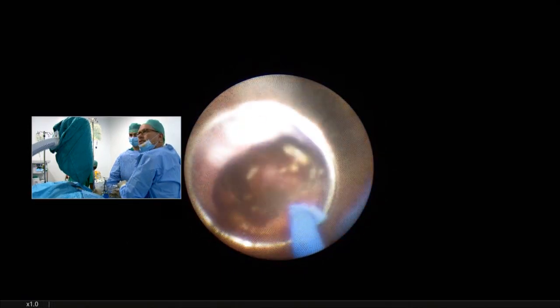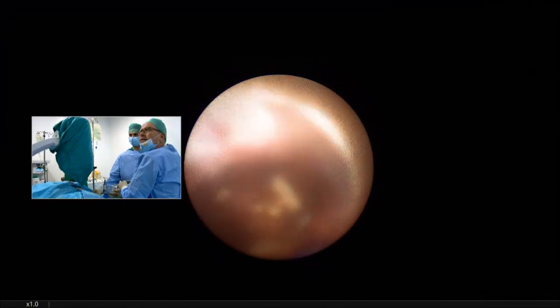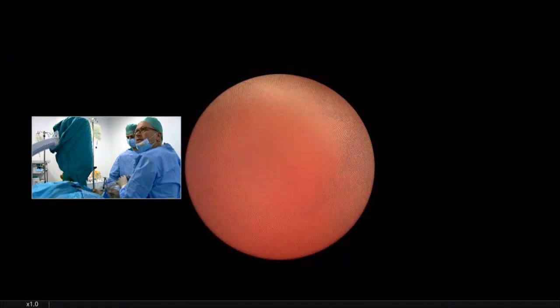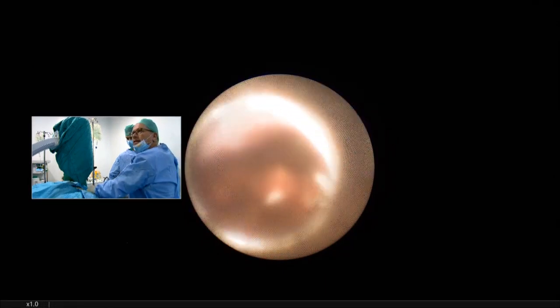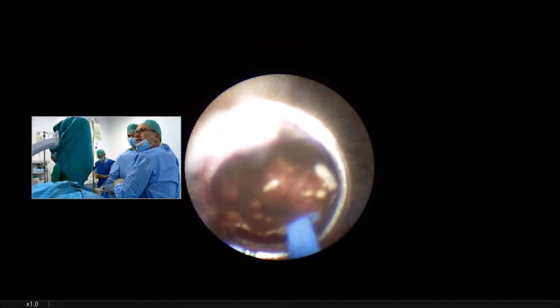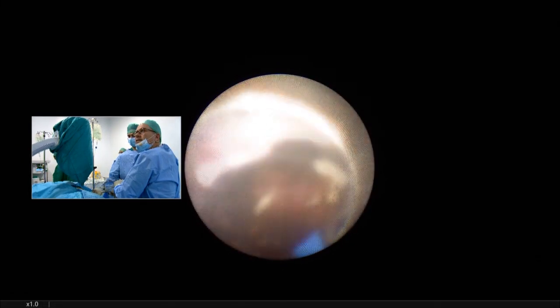I think it does not take a long time now to finish the procedure. Yes. And je ne suis pas d'accord. But pre-operated patients are always very difficult. The kidney is not so soft. And finally, we had 2 punctures.